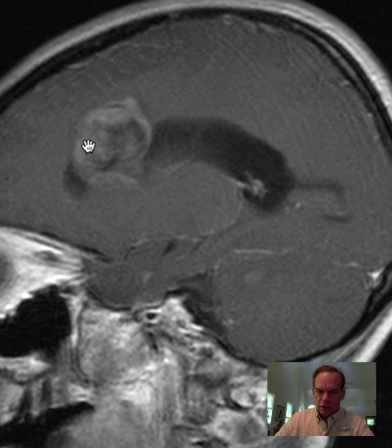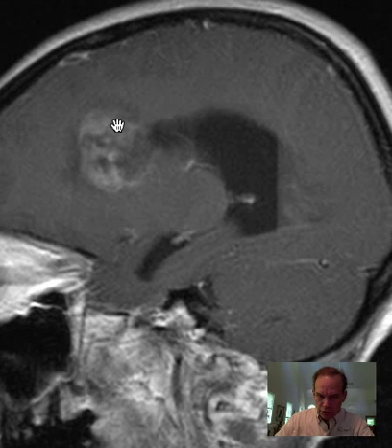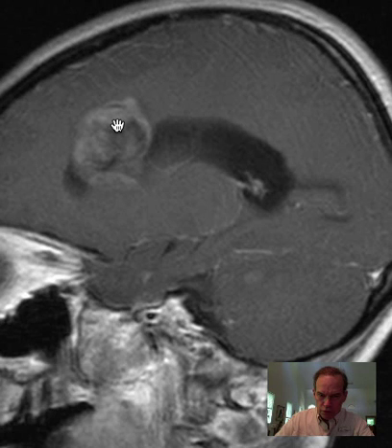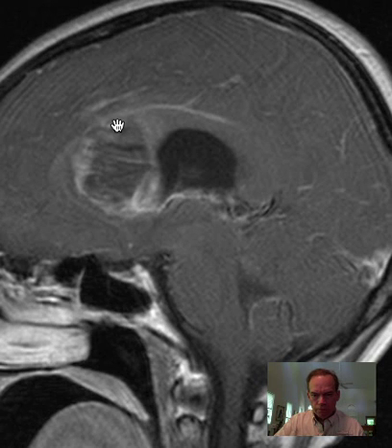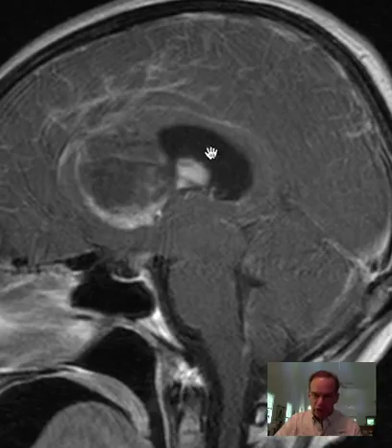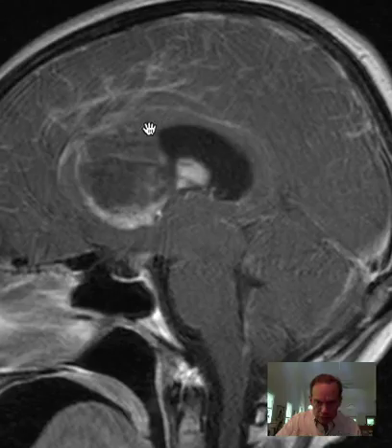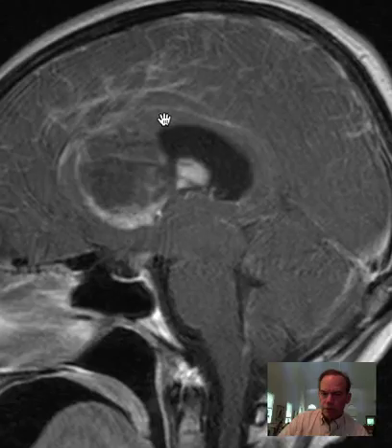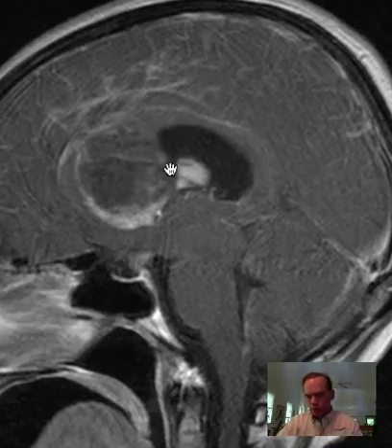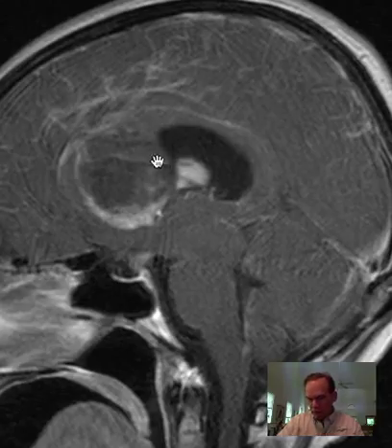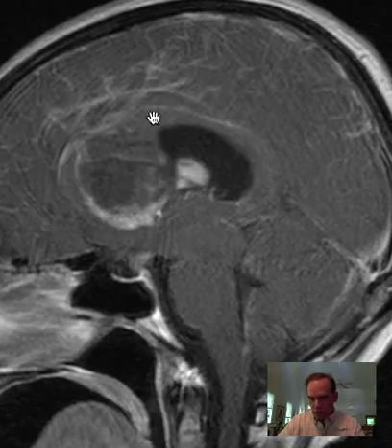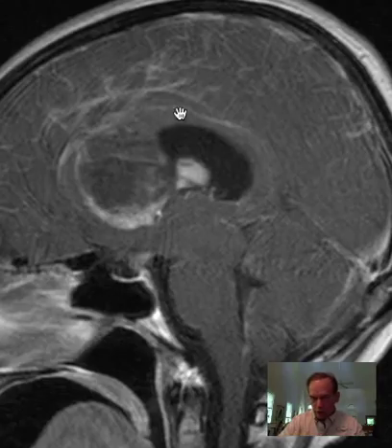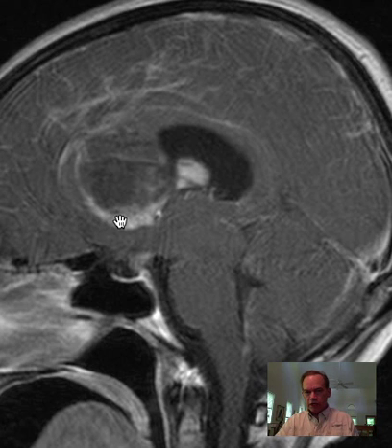You can see nicely depicted the mass as it goes into the left hemisphere and the right hemisphere. What part of the corpus callosum is involved? We don't see it real clearly, but here is the body of the corpus callosum, and this part here is the genu. The mass appears to be arising primarily from the rostrum of the corpus callosum. The corpus callosum is here, and it seems to be emanating from the genu and the rostrum — so this mass arises most prominently from the rostrum, at least at this midline level.